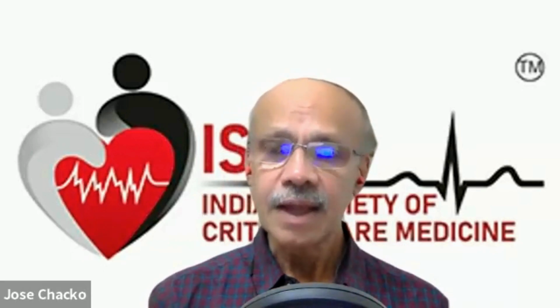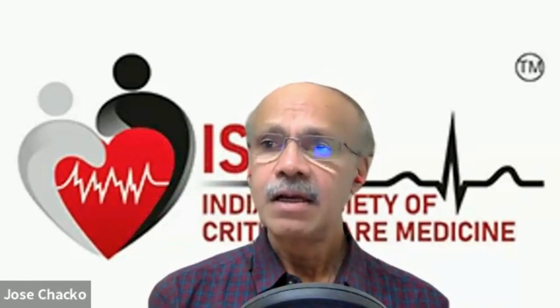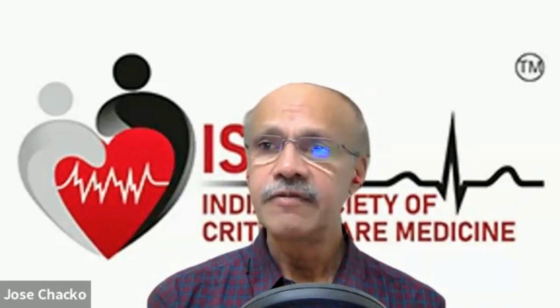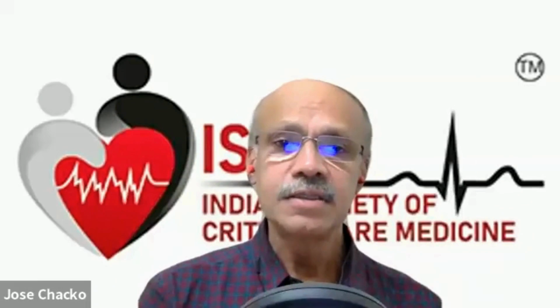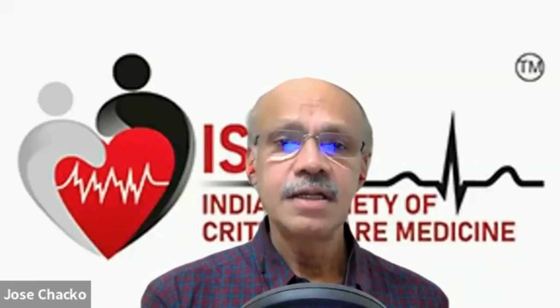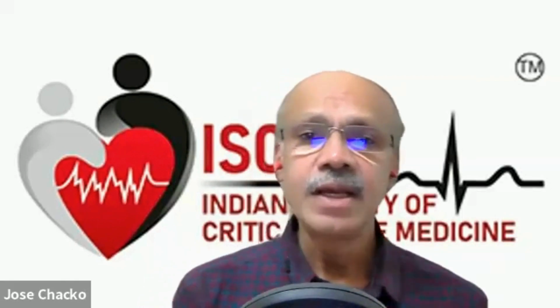Right ventricular size and contractility is another important factor that you would look at, particularly in patients in whom you suspect a pulmonary embolism. There are many patients who might come to you as an emergency who may have hypoxia at baseline with normal lungs, wherein you strongly suspect PE. And in this situation, echocardiography can be a very easy to perform bedside tool. Just eyeballing to look at the ventricle size, the degree of dilatation of the ventricle, and its function.